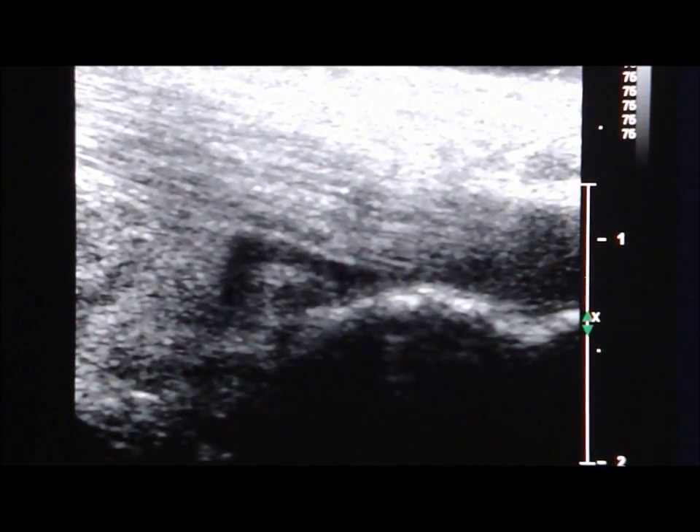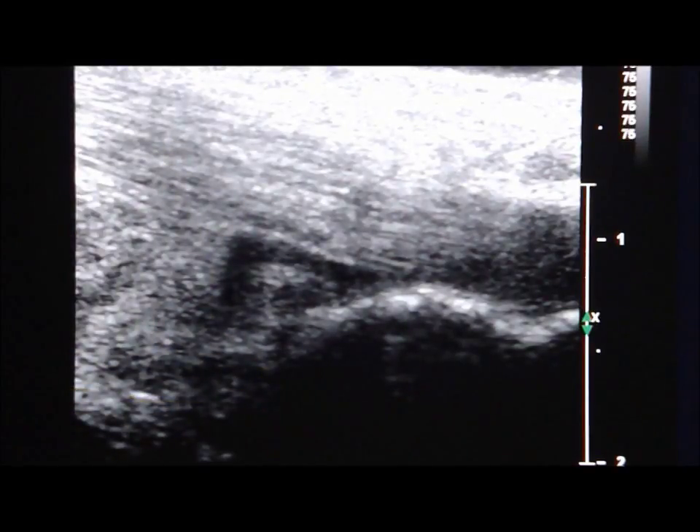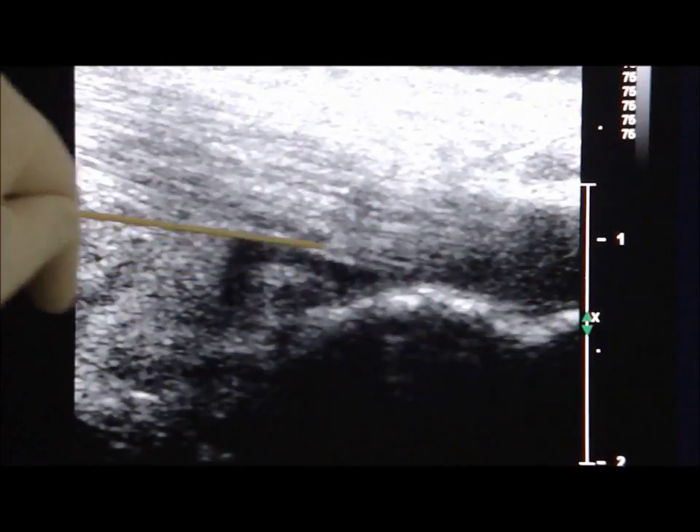During ultrasound examination of the posterior surface of the heel, the patient pursues the prone position. This is the ultrasound image — the sagittal sonogram of the posterior surface of the heel — showing the enlarged retrocalcaneal bursa.